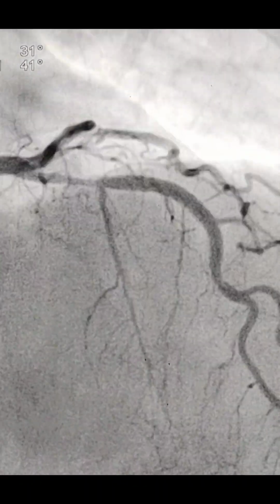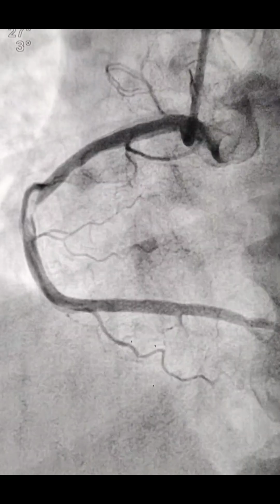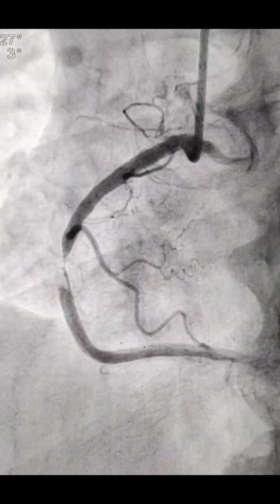This patient is de novo diabetes, and we decided to do the angioplasty to the RCA first, and if the patient is stable then we'll go for the LAD also, with a complete revascularization strategy.